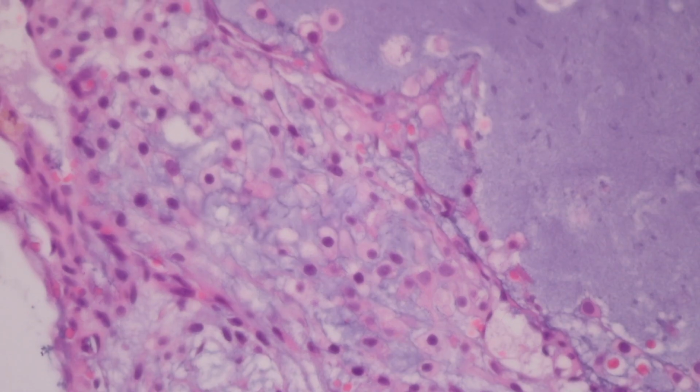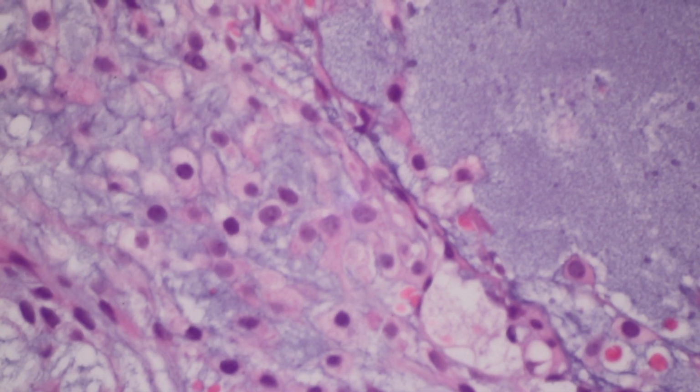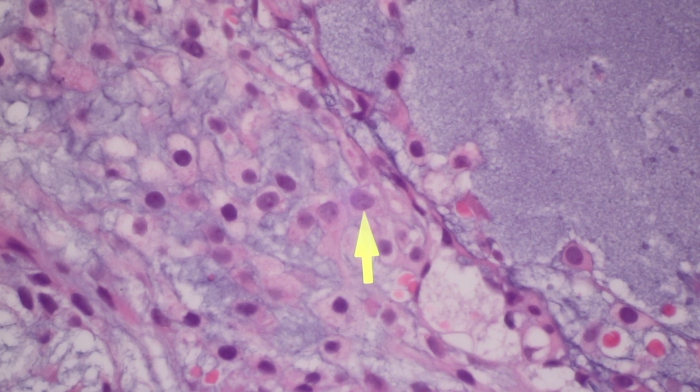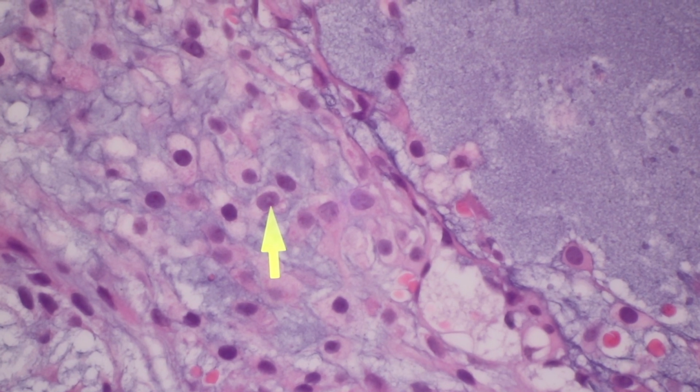Exactly. So we'll go to some cells that show that, like right here. This nucleus is not hyperchromatic. You can see the chromocenters that are present. You can see the nucleolus in this cell.